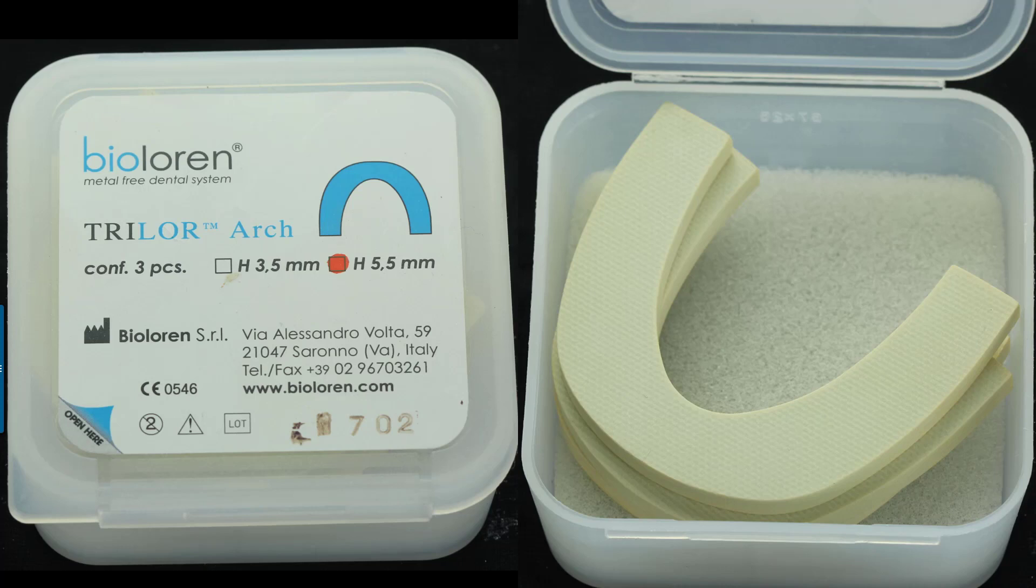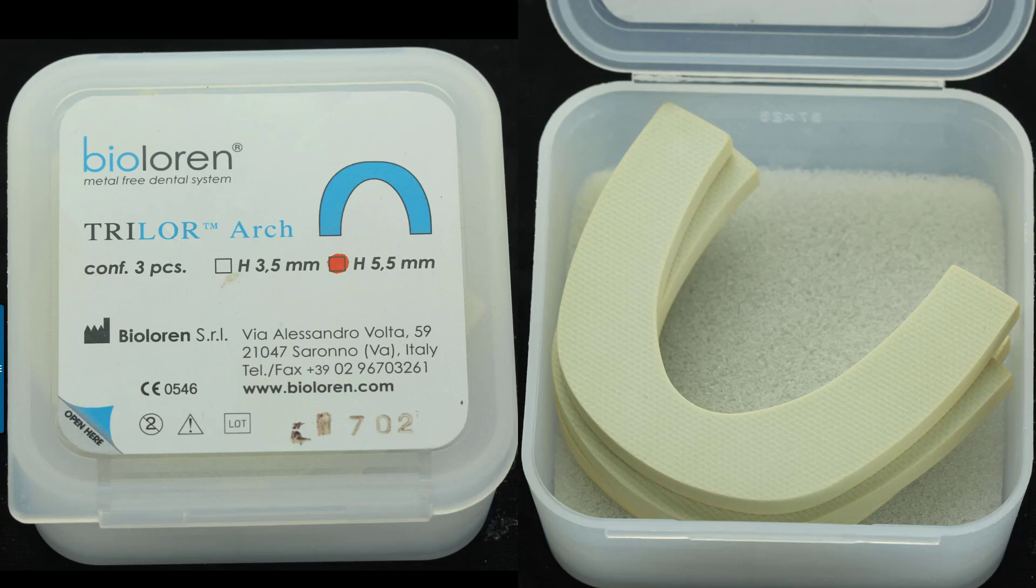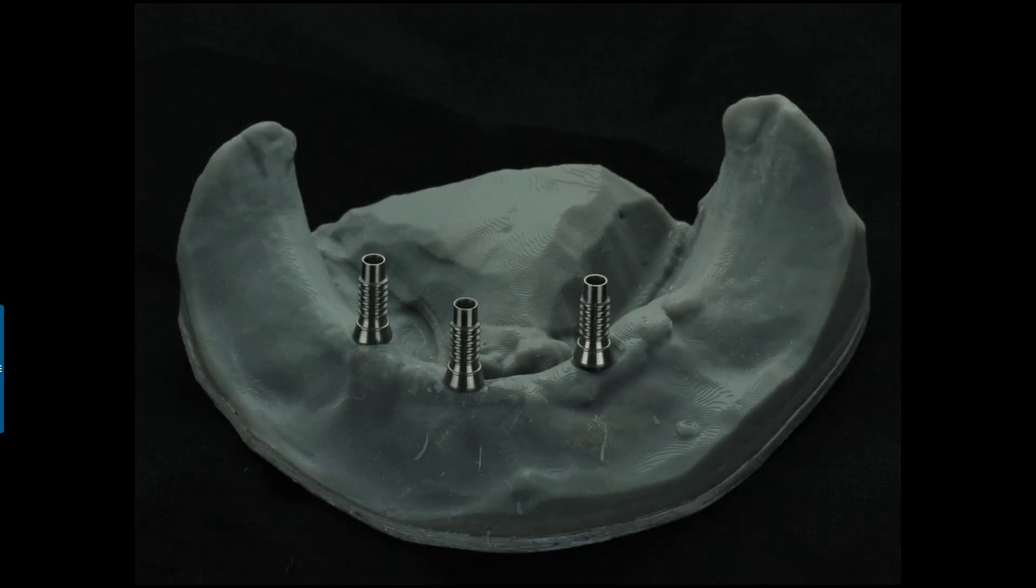So this is what they look like. They're made by BioLoran and it's called Trilor. You can see the cross-hatched pattern of fiberglass embedded in this composite. These come in 3.5 and 5.5 millimeter wafers, but they're incredibly strong, and yet they're already trimmed down enough into these small thicknesses and the shape of an arch, so it enables you to be able to trim these chairside with either a low-speed handpiece or a high-speed handpiece, no need for a mill.